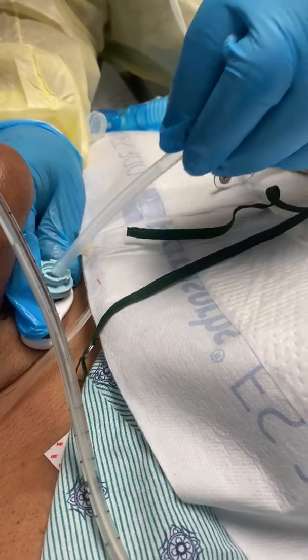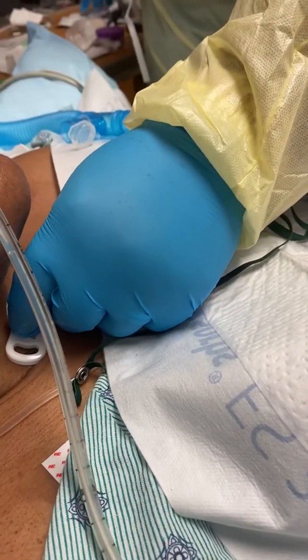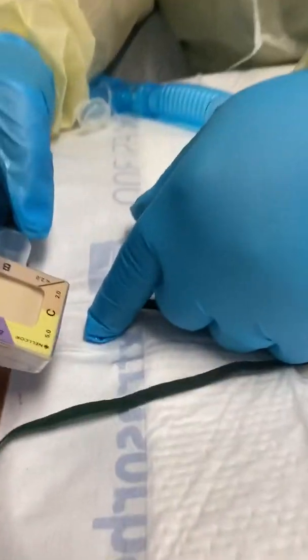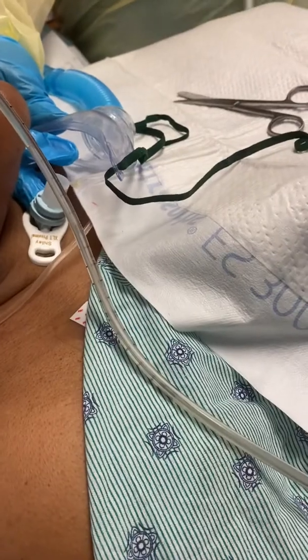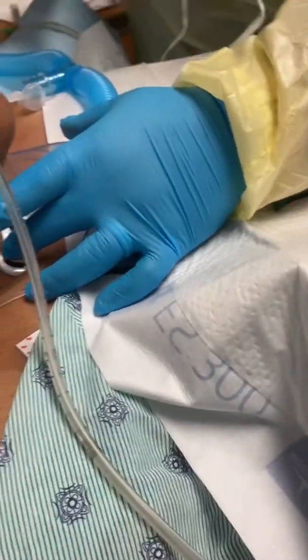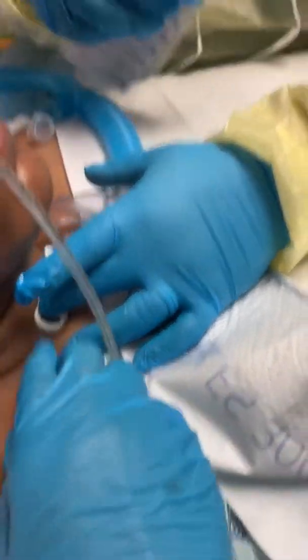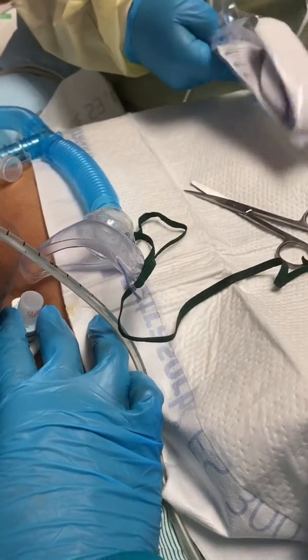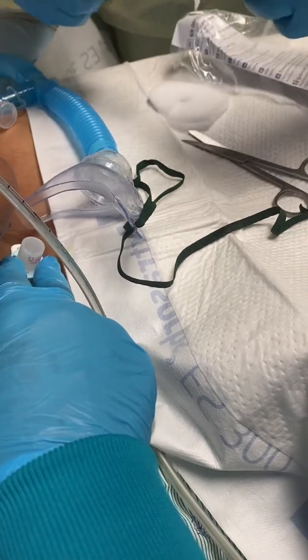Inner cannula. Always maintain control of your trachea. It turned yellow — so we're definitely in the airway. Now all we have to do is put the new ties on. The ties are just regular trach ties. You can hold that slot for me.